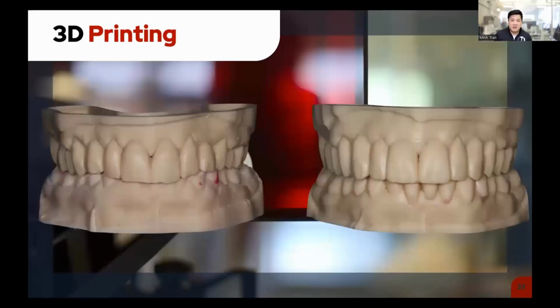So of course, that case that I spoke about earlier, Jenny, you can really appreciate what the models printed off, how different it was from her initial models to what we had mocked up here. And the effort that went into planning this case, opening the VDO, making sure that everything would work out very well. We did some crown lengthening as well. I think we patterned provisionals for 6 months. But the goal here is to really show the patient what changes are possible, right?